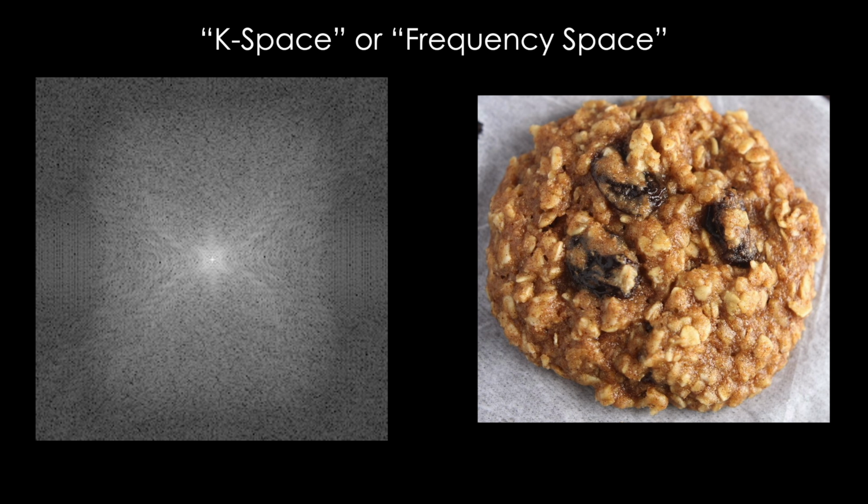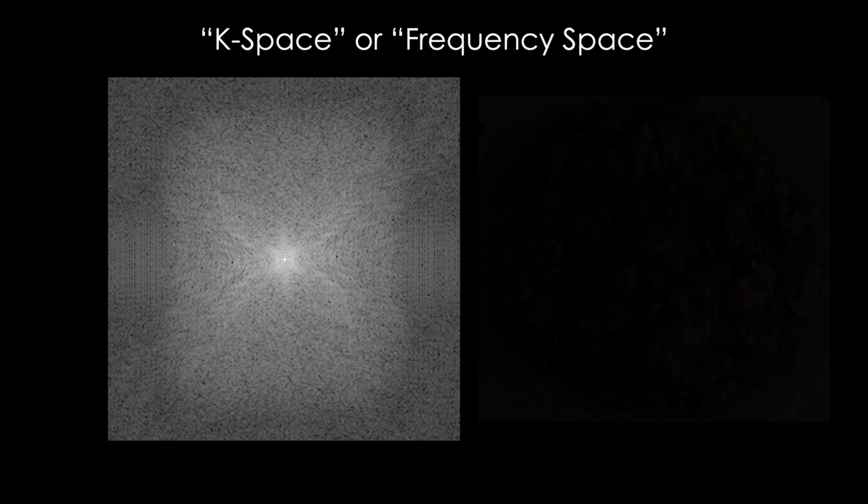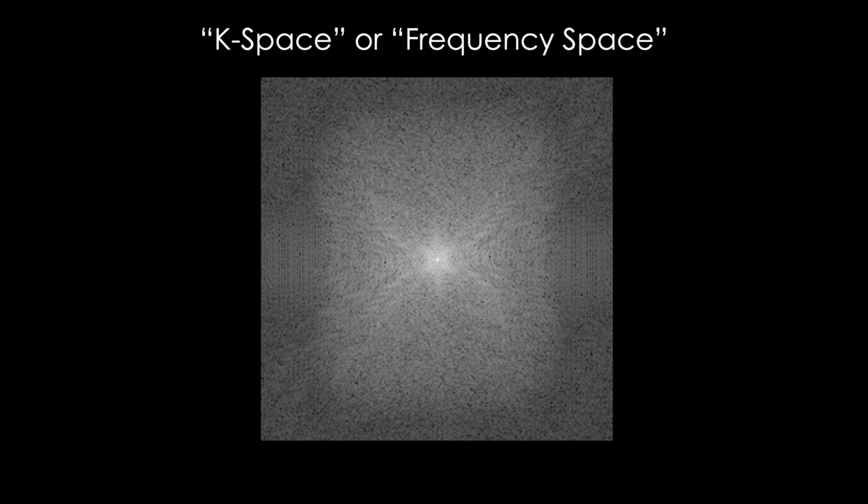It's known only to the baker. Same thing with this picture of K-space, except even worse, at least the cookie was in the final form. This isn't even our MRI picture, nor is any human seeing this picture at any point in the process. If you go to the person running the MRI machine and ask to see K-space, they'll probably look at you like you're crazy. At least they did to me. So then what's the use of this picture?